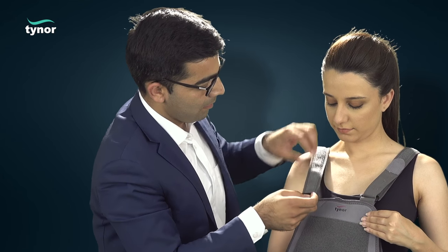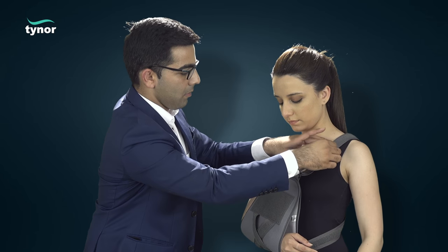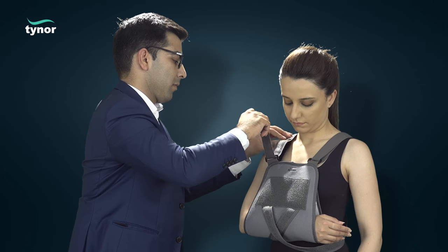The straps are passed through the reverse buckle mechanism and pasted using hook and loop tapes at the required horizontal position of the arm.